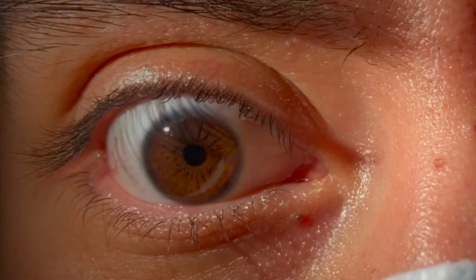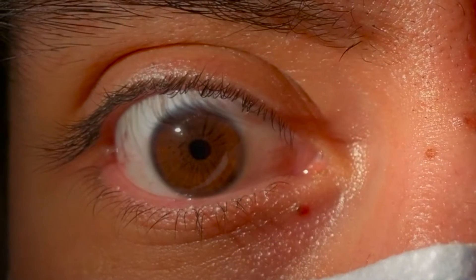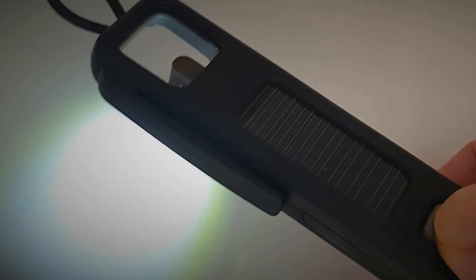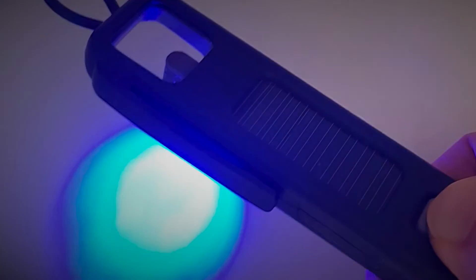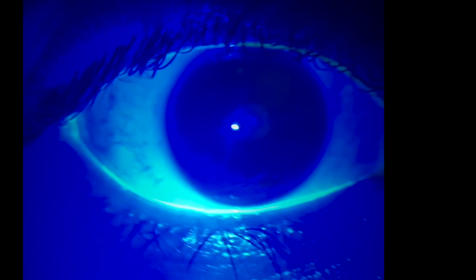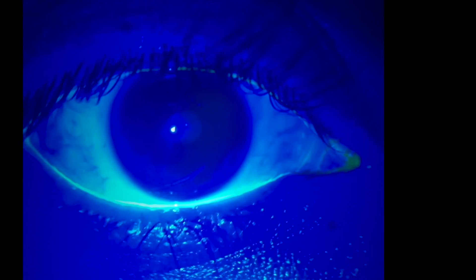This is a normal examination with no shadow. Now select the blue light on the arc light. With fluorescein dye, the tear film, areas of epithelial loss and disease will be highlighted. The dye fluoresces brightly with the blue light. Record in a diagram the site and size of areas of epithelial loss and disease.